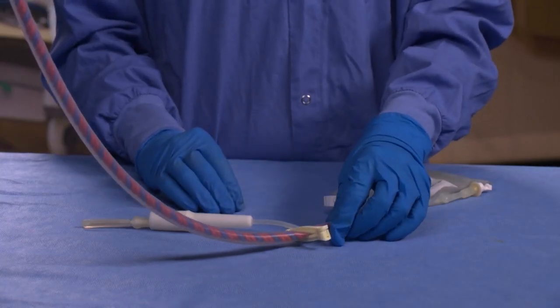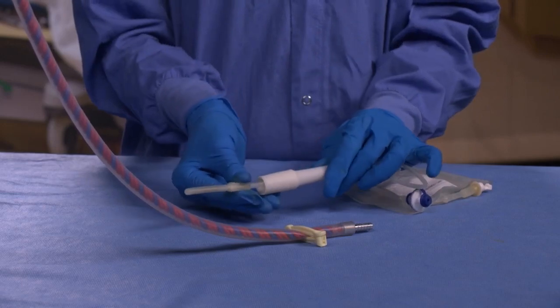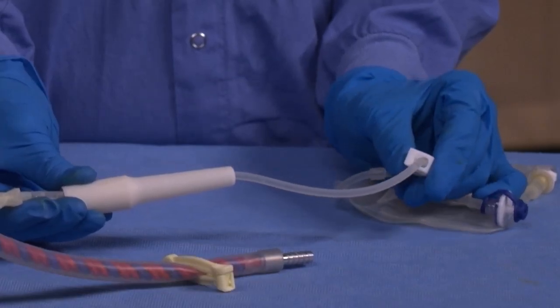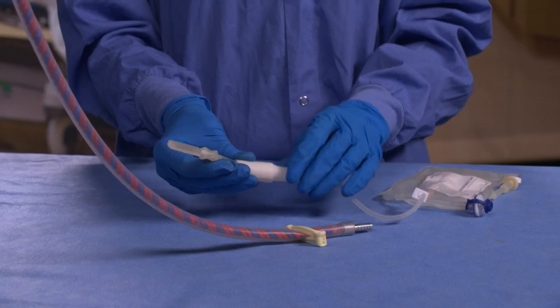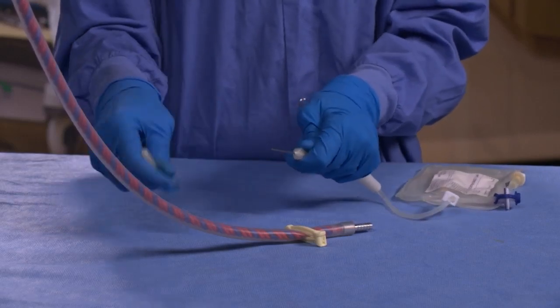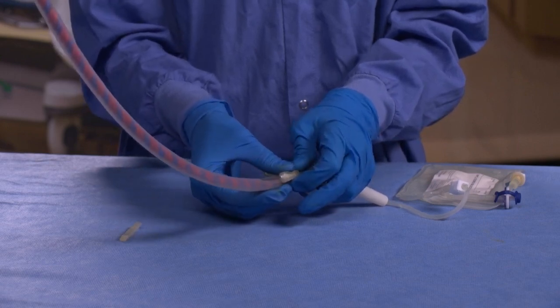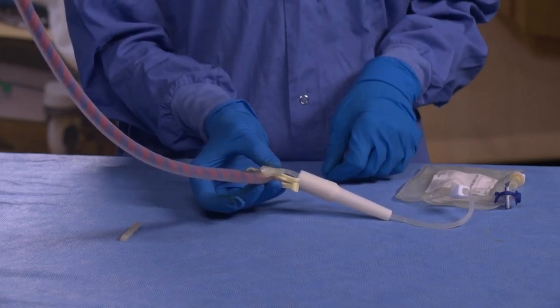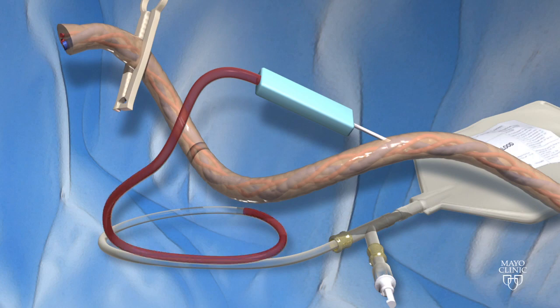Now collect the cord blood. Keep track of the number of needle insertions made during the collection if more than one insertion is needed. Take the donor care needle guard and position it on the cord tube between the needle hub and the pinch clamp. Engage the pinch clamp by pressing down on the white clamp. Check to make sure the cap is placed securely on the air vent so no air can escape. While the pinch clamp is in place, find the umbilical vein in order to insert the needle into it. If the needle penetrated all the way through the vein, the blood will not be able to run into the collection bag. To get the most out of the cord blood, the needle insertion site should be just above the clamp on the cord. To collect the cord blood, you need to open the white clamp on the collection bag tubing to start the blood flow. The blood will mix with the anticoagulant in the bag.